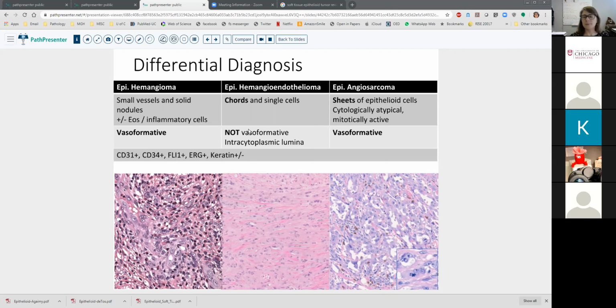As far as IHC for lymphatic markers, I know we have D2-40. Do we have VEGFR3 or LYVE1? I don't use them, so I don't think we have them. If anybody knows differently, please speak up.